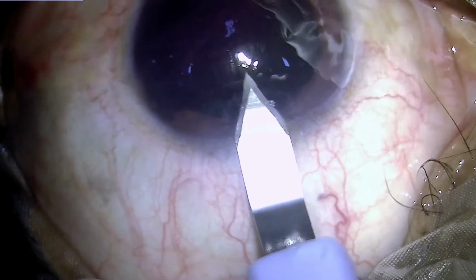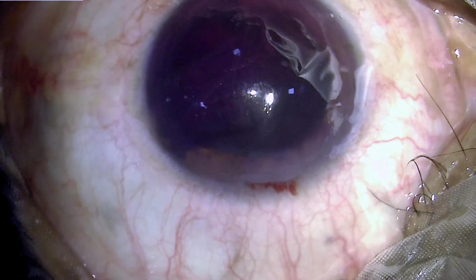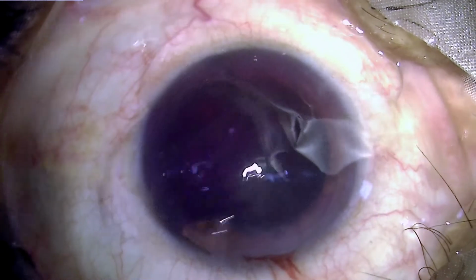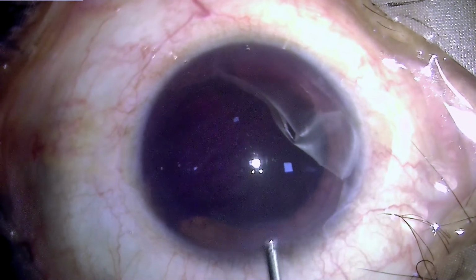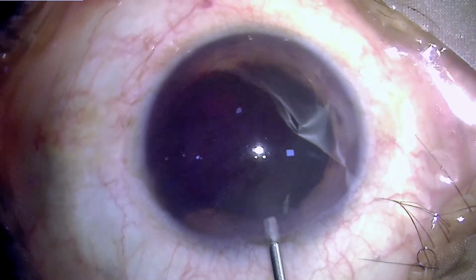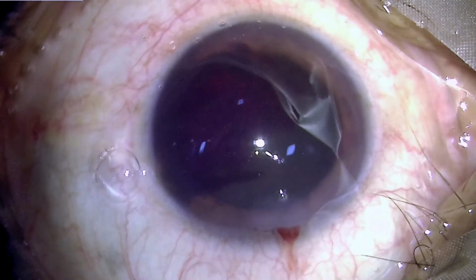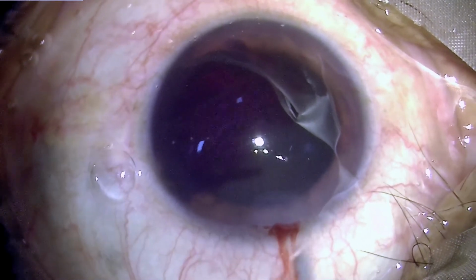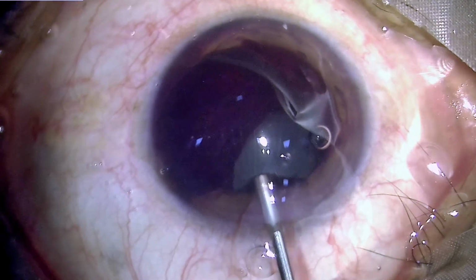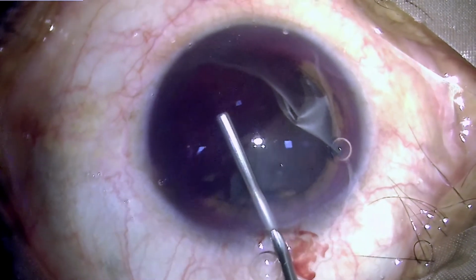Once the anterior chamber entry has been created, intracameral lignocaine has been introduced, which washes away the part of the bleed which is liquefied and collected in the anterior chamber. Usually the anterior chamber bleeds don't get clotted, the reason being that once the blood is mixed with the aqueous, the clotting factors are diluted to the extent that they cannot polymerize and cause a clot. However, as we can see in this case, whenever the bleed is in larger quantity, the dilution effect of the aqueous is nullified and the blood can clot.